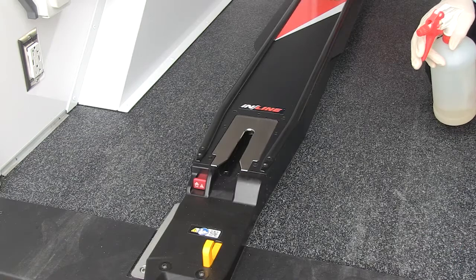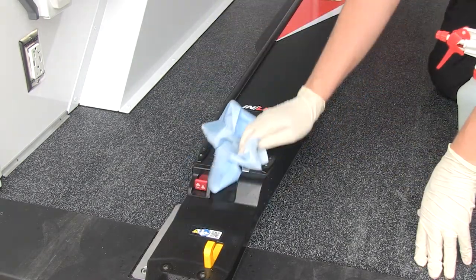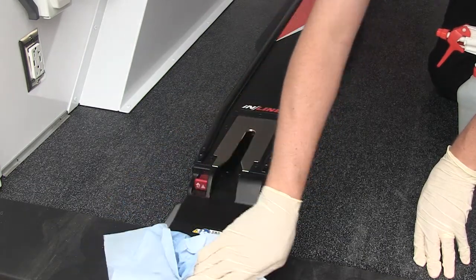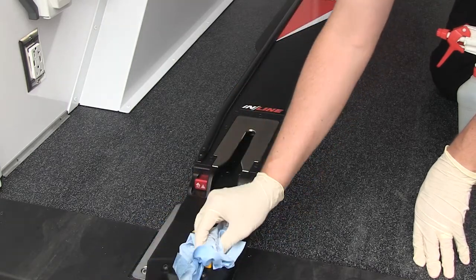To disinfect the inline fastening system, wipe all surfaces with disinfectant. Follow the disinfectant manufacturer's instructions for application method and contact time. FERNO recommends you inspect the fastening system for damage as you disinfect.